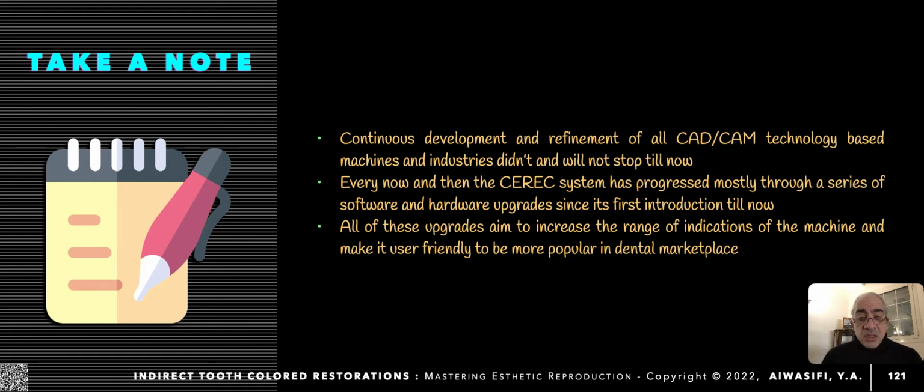Every now and then, the CEREC system has progressed mostly through a series of software and hardware upgrades since it was first introduced. All of these upgrades aim to increase the range of application of the machine and the range of restorations that you could construct from it, also to make it much more user friendly, more popular and much easier to use in the dental marketplace.